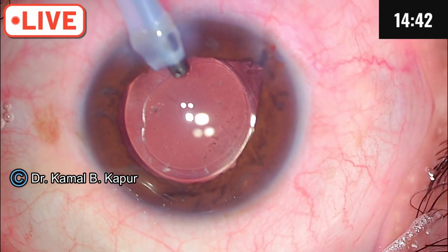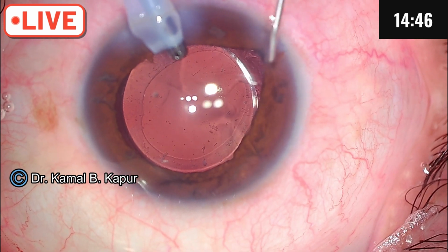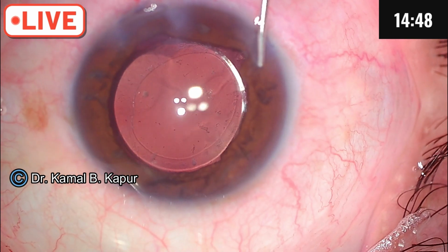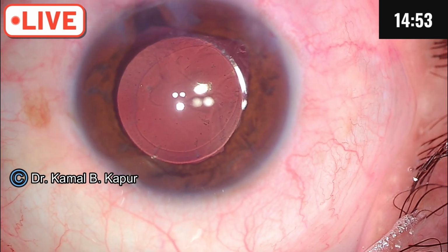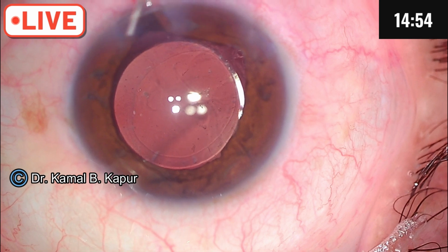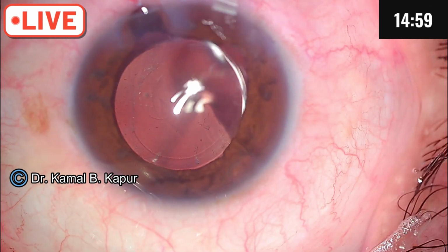IA, hydration. Now again we'll have to make sure that as I come out I keep the anterior chamber hydrated. There. So this iris protruding out sometimes is helpful for the surgeon because it will ensure that the IOP doesn't come down suddenly.